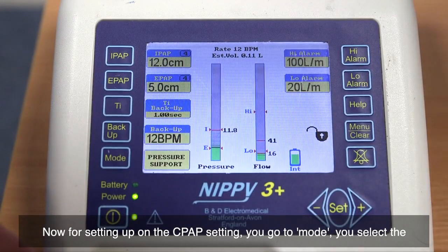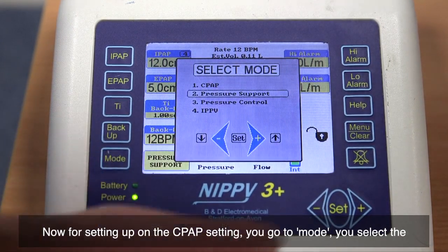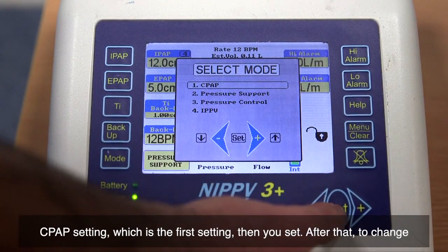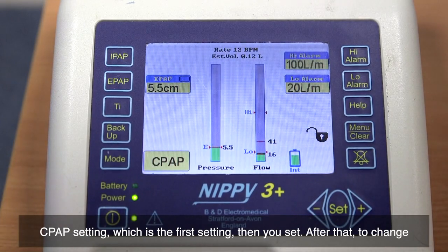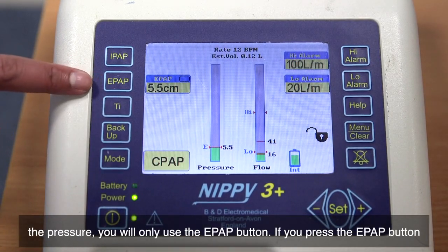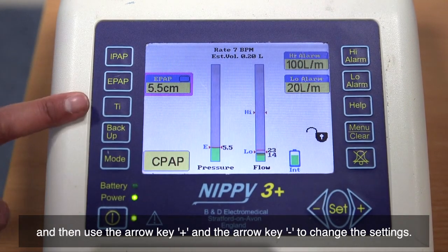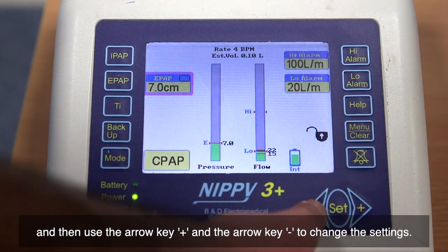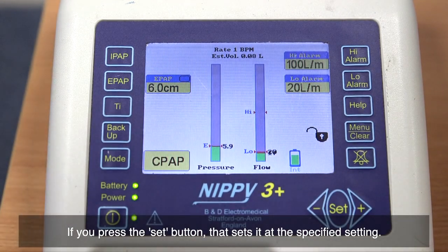Now for setting up on the CPAP setting, you go to mode, select the CPAP setting which is the first setting, then press set. To change the pressure, you will only use the EPAP button — press EPAP and use the arrow keys plus and minus to change the settings. Press the set button to confirm at the specified setting. Currently, the machine is set at 6 cm of water pressure.